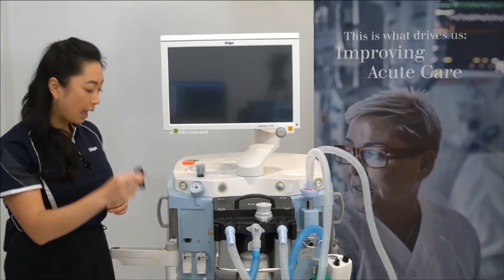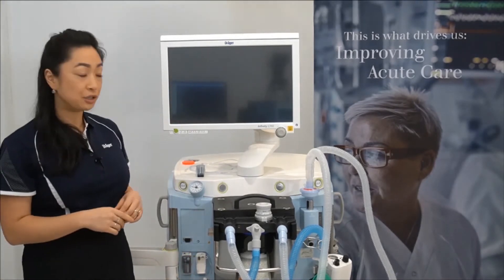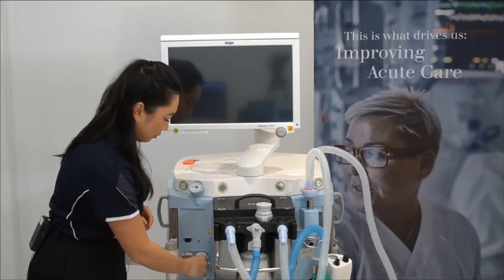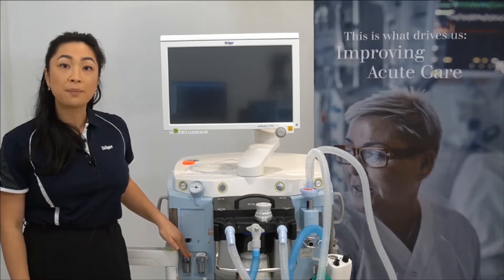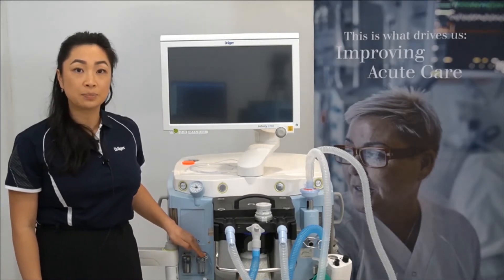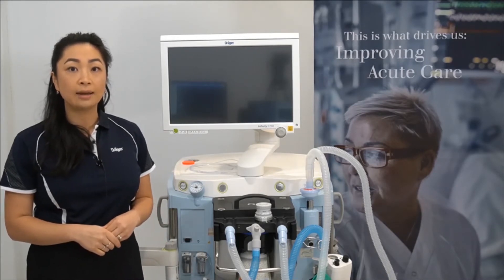To insert the water trap, squeeze the clips and firmly push in until you hear a click. Do the same again with the second water trap. The first water trap is a CO2 water trap, and the second one is known as a protect water trap for the internal sample line for the gas sensors.